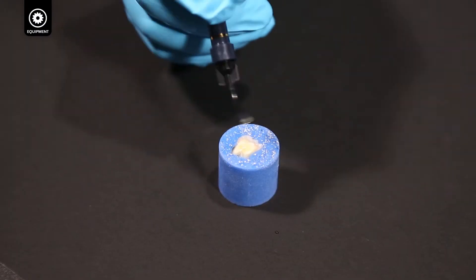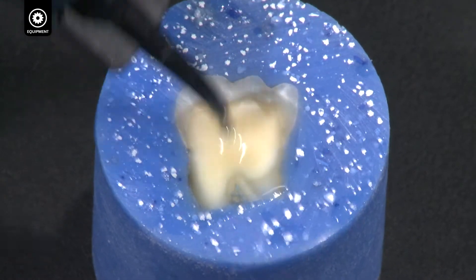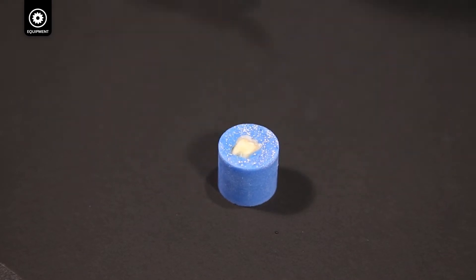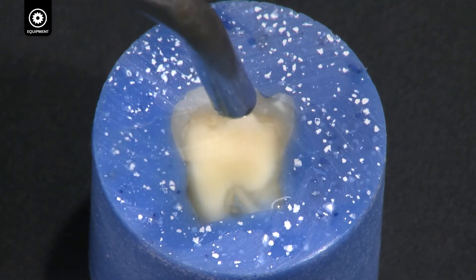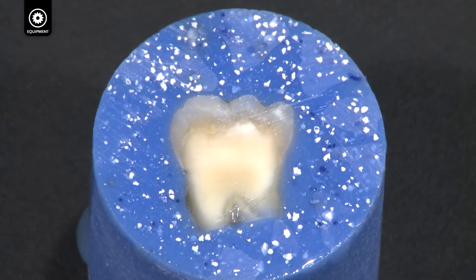Apply Peak SE primer to the damp specimen for 15 seconds. Blow off excess primer and or use high volume suction. No visible puddles should exist.